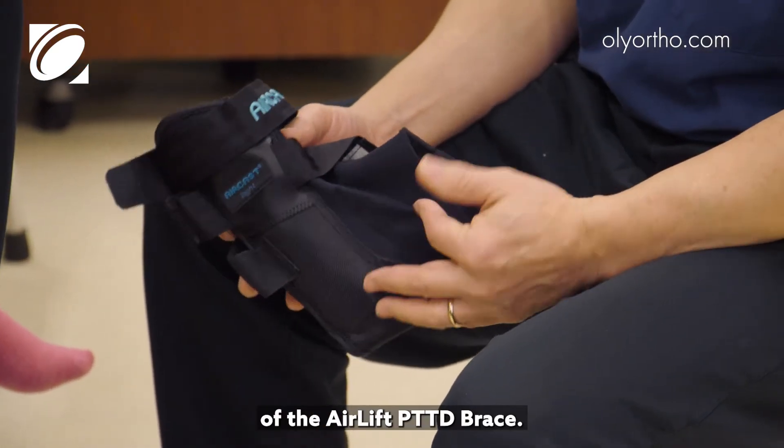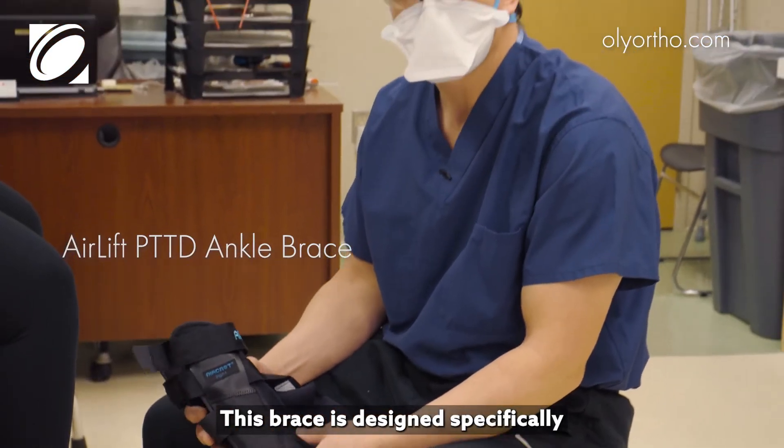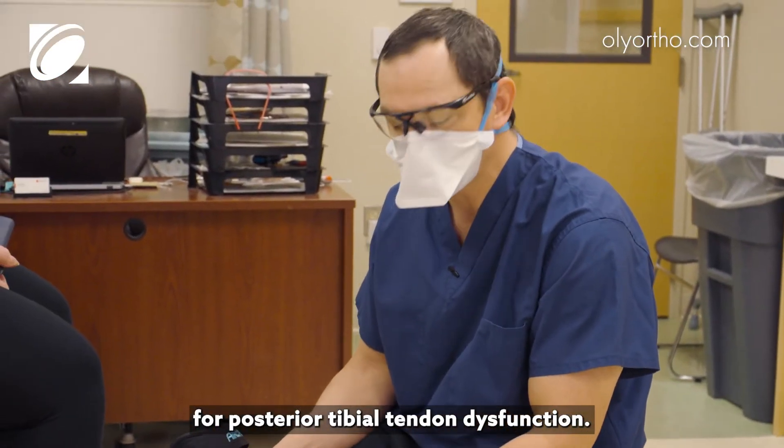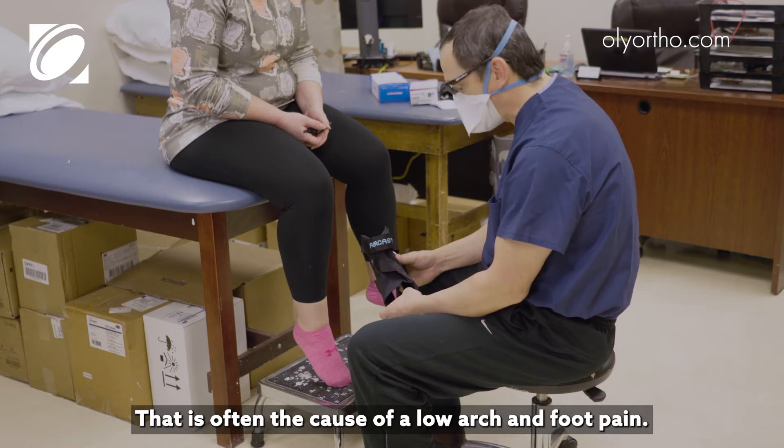Today we're going to go over application of the Airlift PTTD brace. This brace is designed specifically for posterior tibial tendon dysfunction, which is often the cause of low arch and foot pain.